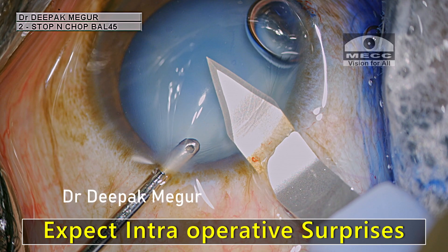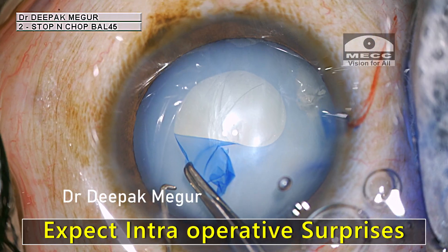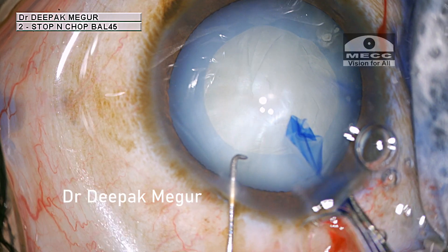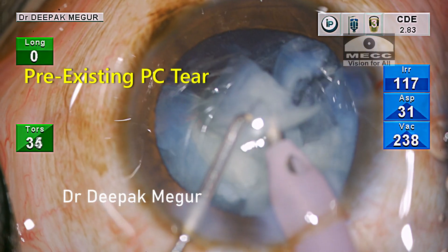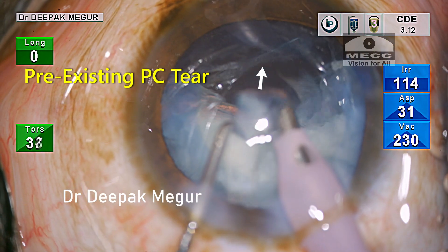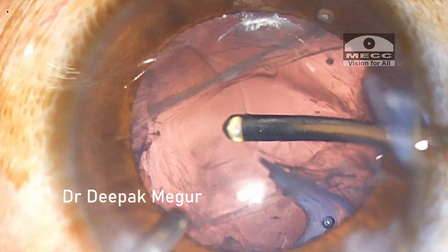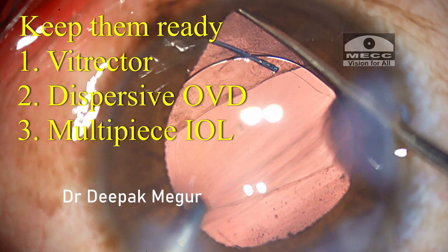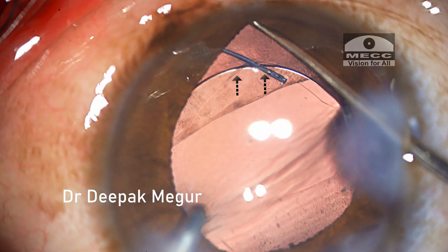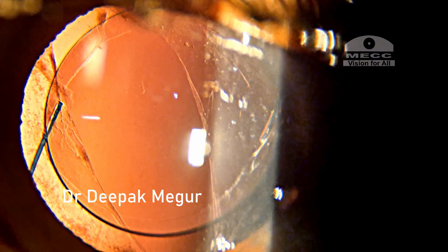To summarize: expect intraoperative surprises when dealing with unusual cataracts, especially in young patients with traumatic cataracts. We should be prepared to manage a pre-existing PC tear as was the case here. Even though some of them look like routine cataracts, it's imperative that we keep our vitrector and a multi-piece IOL handy, as they can be lifesavers in such situations. Thank you for your attention and hope this helps.